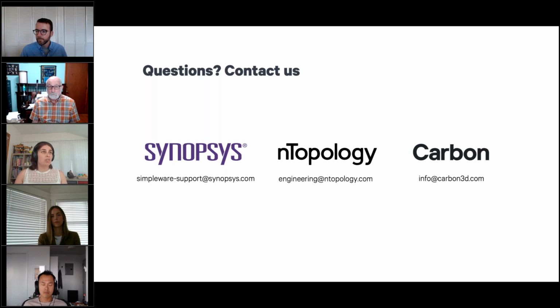Simpleware ScanIP Medical is FDA cleared, and if you check on our website, you can see all the certifications there. The AI algorithm that I showed you is slightly different, and that's for research and development purposes at this point. But if you want to have a look into that further, I'd say contact us.